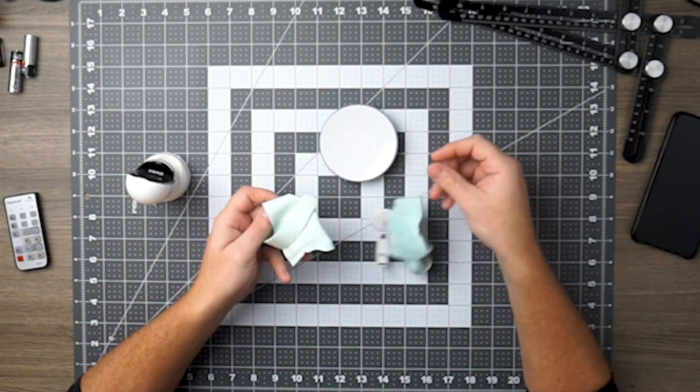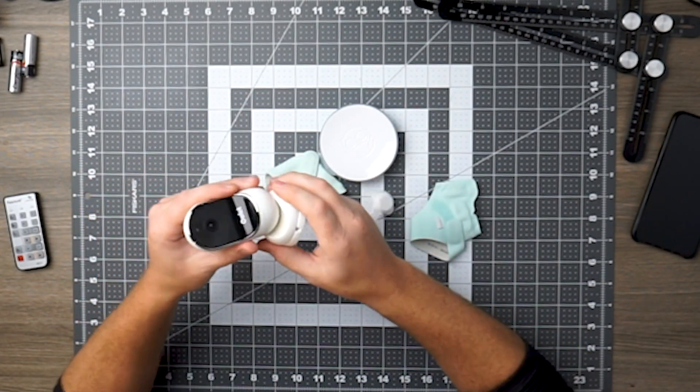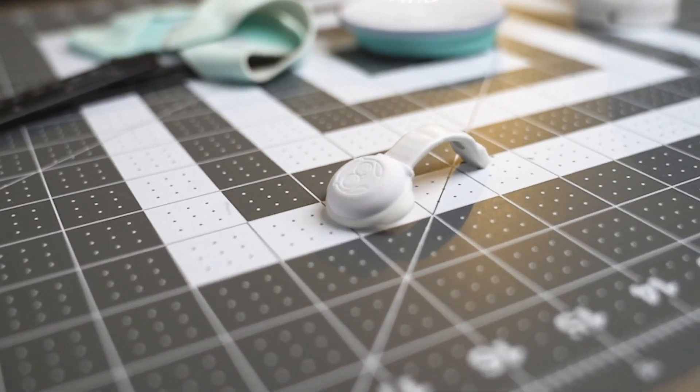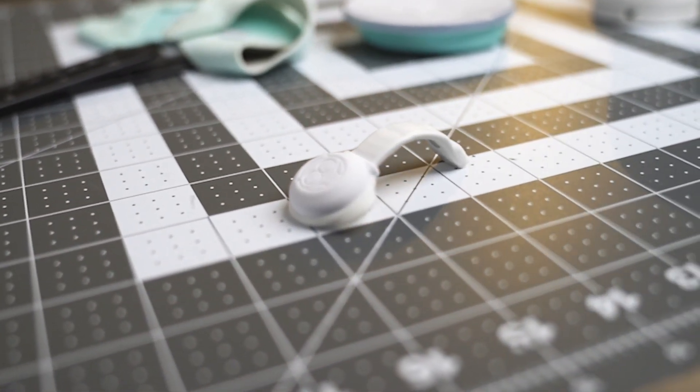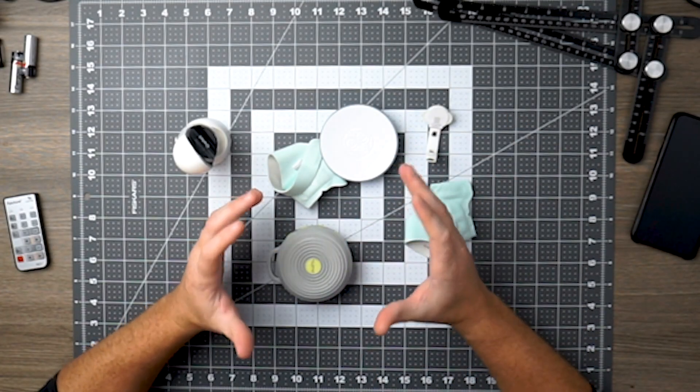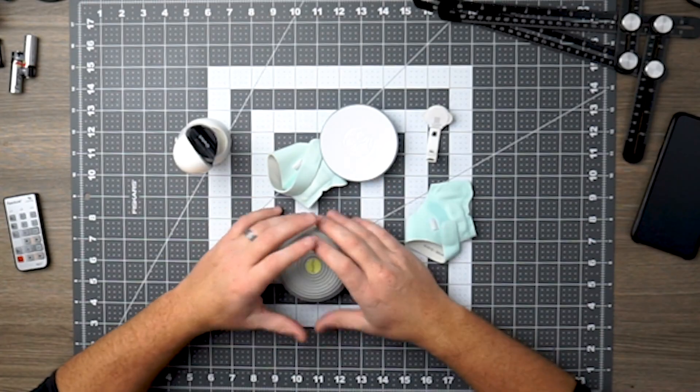There are a lot of things to manage with this bundle: the base station, the socks, the sensor, the camera, and the cords. You need to make sure the sensor is charged — the app does have a battery status indicator, so at least you'll know when it needs charging. But overall, there's a lot of maintenance involved. The camera also does not have white noise, so you'll need to plug in a fourth device, adding to the maintenance of providing your baby with a great sleeping environment.